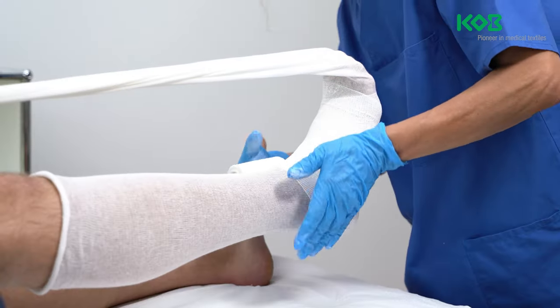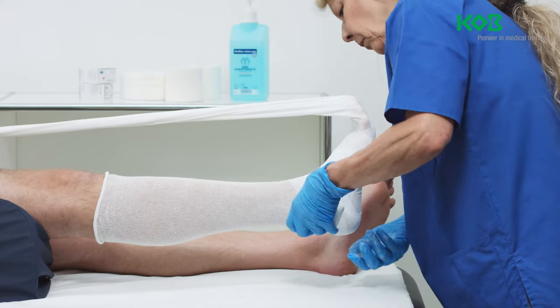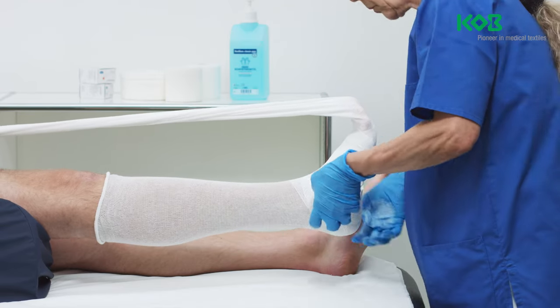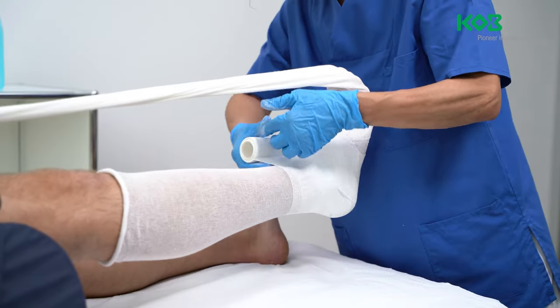Moving from the medial malleolus to the instep, flatten the bandage over the anterior portions of the tendon to cover them. Wrap the bandage around the Achilles tendon and the medial portion of the heel.